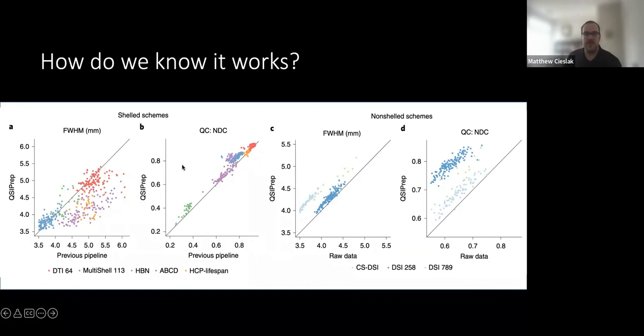The next metric that we used comes from DSI Studio, and it's called the neighboring DWI correlation. And it's a metric between 0 and 1. That's a weighted correlation coefficient image-wise between your B greater than 0 images. So if you look at an image coordinate in Q space, you can tell the distance between that image and another image.